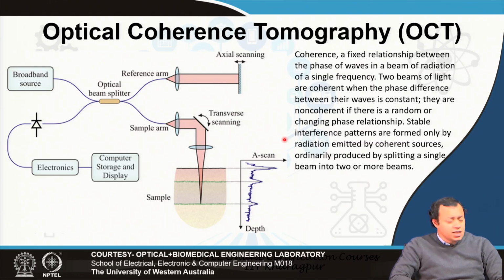Optical coherence tomography does not break the diffraction limit, but you need to know it because it is an incredibly handy tool when it comes to medical imaging, ophthalmological imaging, or tissue imaging, etc.